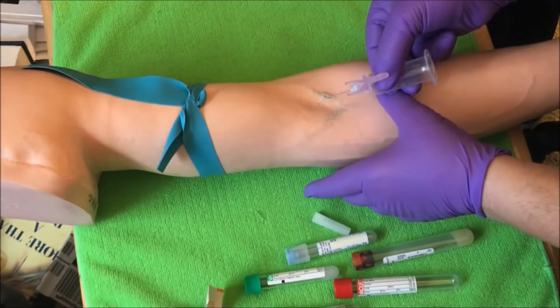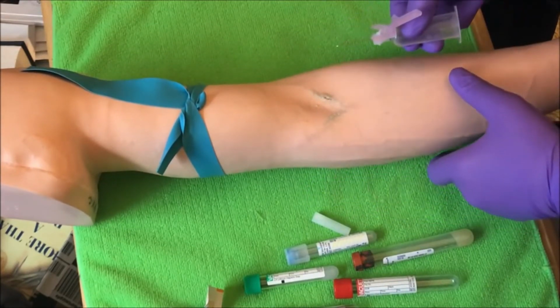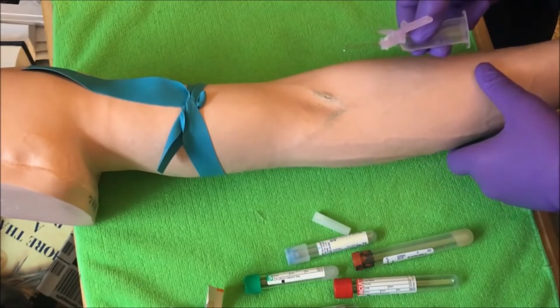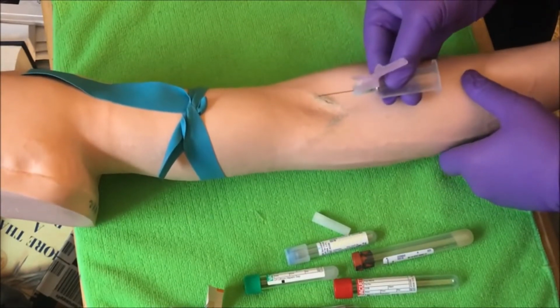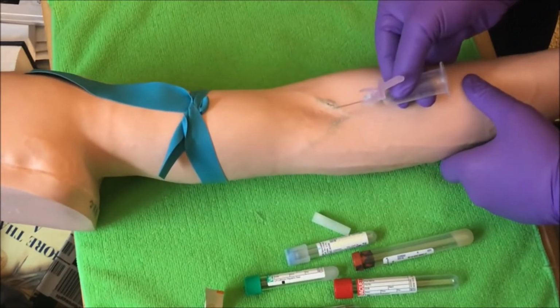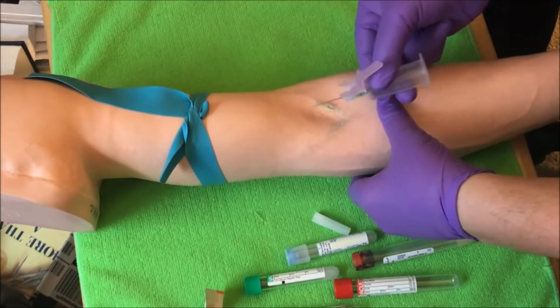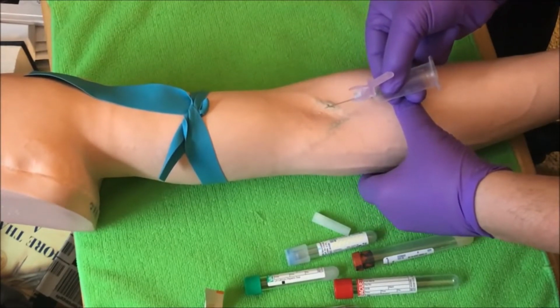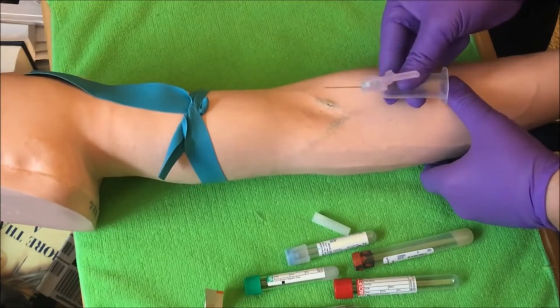That will increase my angle of insertion, and that can also cause me to miss the vein or go too deep, and can cause harm to the patient as well. I want to retract towards the forearm or below towards the wrist, pull back so I have enough free area right here to go ahead and draw with no problems. So again, do not retract up here where my thumb is. If I'm doing this, then I'm too close. Retract below so I have a good angle, 15 to 30 degrees.